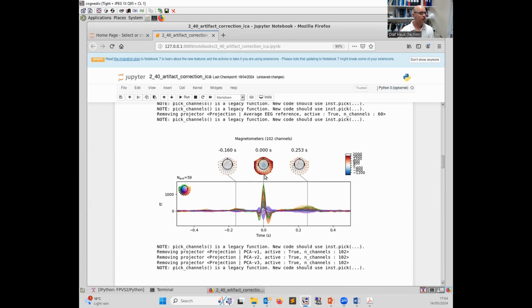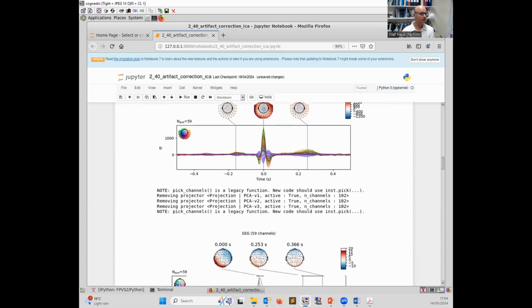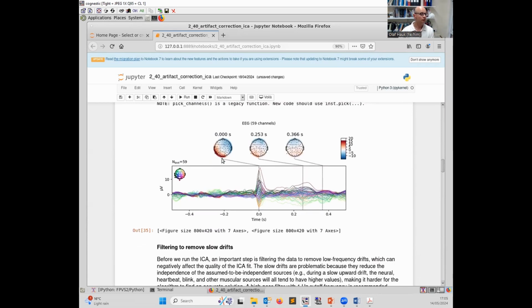And yeah, this is the topography in the MEG. So it's usually the inferior sensors here at the border that are affected, but not just, but only those. Depends a bit on how the heart dipole is oriented. And yeah, this artifact is also present in the EEG.